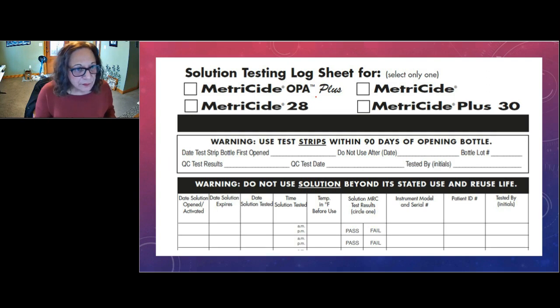Aside from all that, sorry, I talk with my hands. Aside from all that, the one thing you want to remember is those are two separate processes. The point of the ultrasonic is to clean your instruments. The point of the soak is to high-level disinfect or cold chemical sterilize, kill the cooties, basically. So you have two separate processes, and it needs to be handled that way as well. Next question.